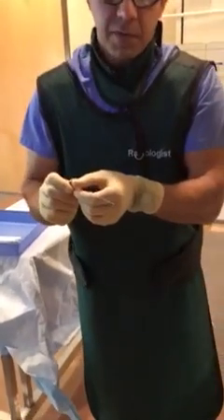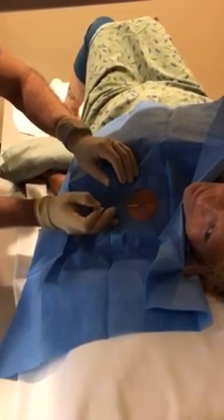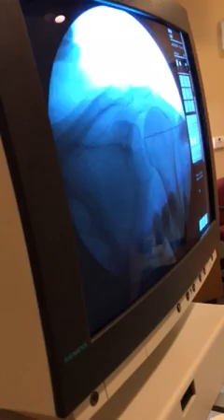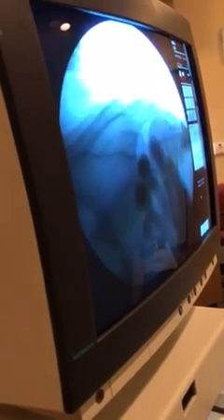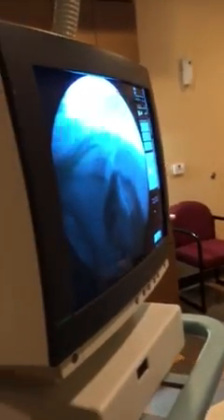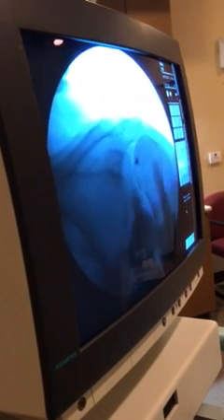The spinal needle has a bevel — you might want to have the bevel facing inward, but it's not too crucial. You'll find this spot that you're going to go into again. If you look at the screen, you'll see where my needle tip is right there, right on the edge of the humeral head, near the top of the bony glenoid, just a little bit down from that. That's exactly where you want to go. You can guide it right down.